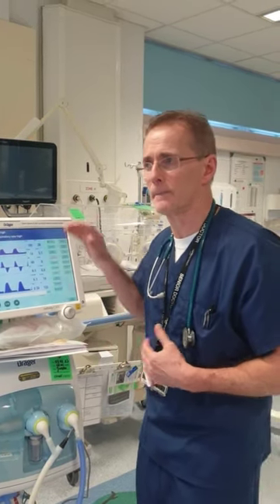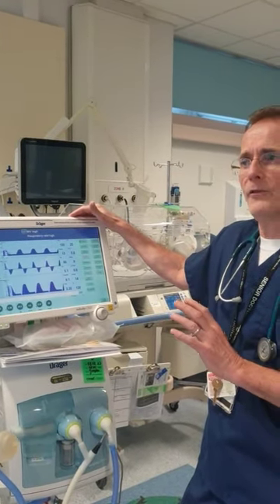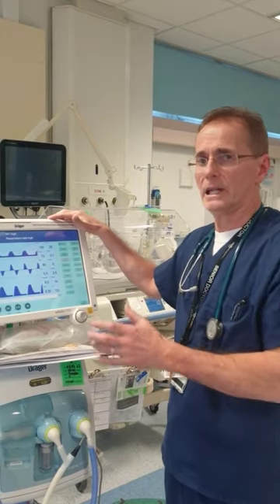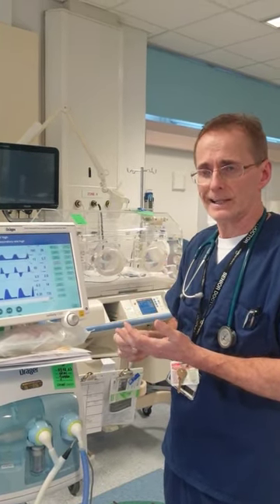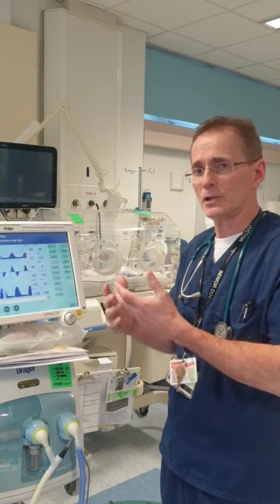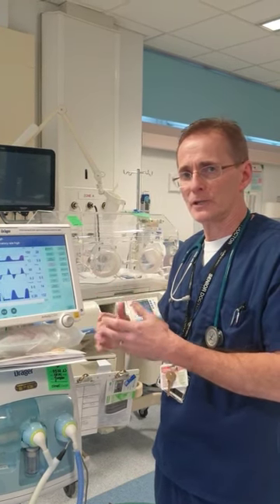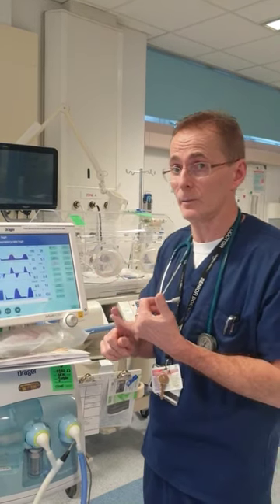from conventional to oscillation. If we go from conventional to oscillation, it's really important to make sure we've done all the right things for the baby: that we've got the right size of ET tube, that there isn't a significant leak, that the baby is sedated, volume loaded appropriately, and that we've done a chest x-ray to make sure we're not missing a pneumothorax or that the tubes aren't in the wrong place. So we do the basic things properly, the simple things properly. That's one important point.